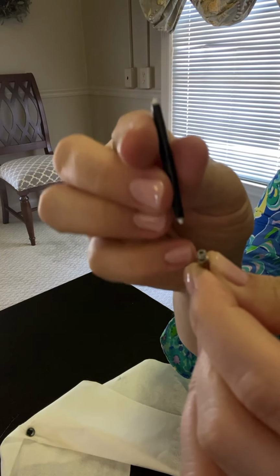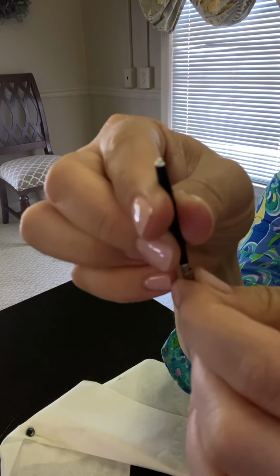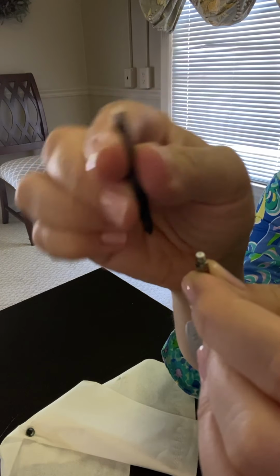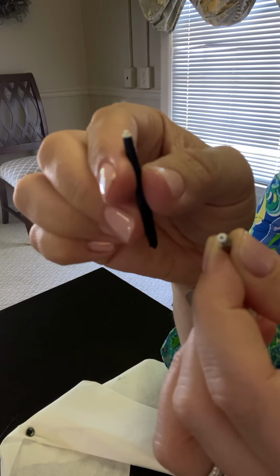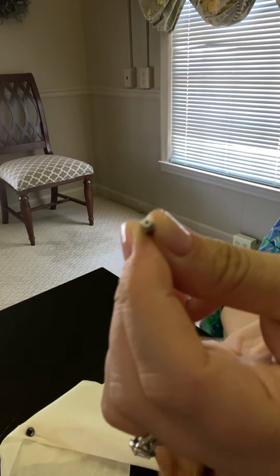Flip this over, and the white piece is your new filter. So again, straight down and straight up. No rocking back and forth. And that leaves your new filter. And then you'd simply throw that stick away with your old filter.